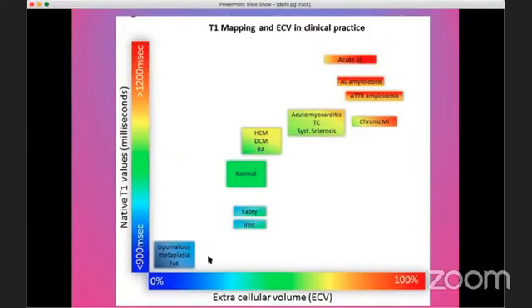And the application of both are able to divide some of the cardiomyopathies into different groups. To again reiterate the point, the lowest native T1 values are seen in lipomatous metaplasia, typically in chronic infarcts with a lipid metaplasia, and also in fat-containing tumors like lipomas. The other disease entities which have a very low T1 value and a low ECV are Fabry's disease and iron deposition is slightly lower than the normal variant.